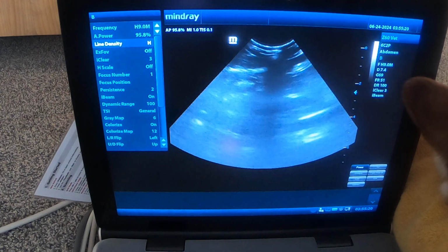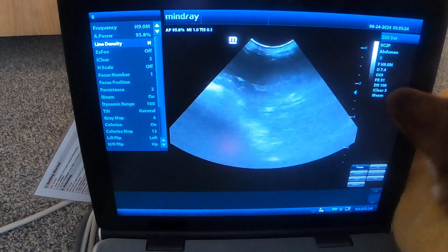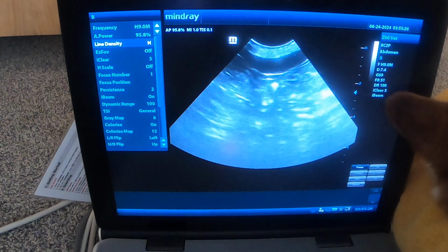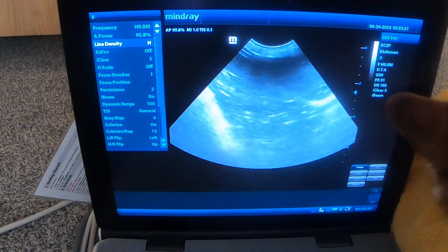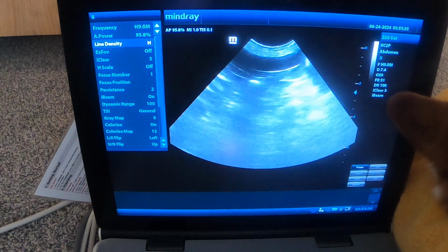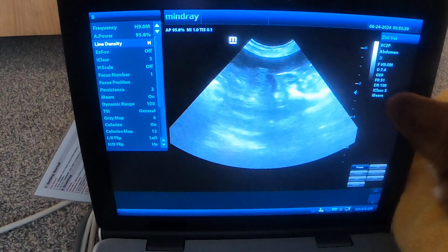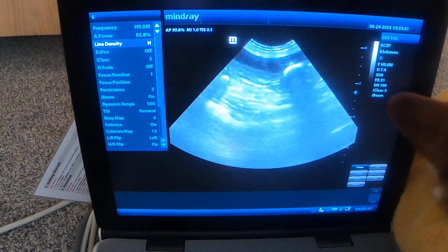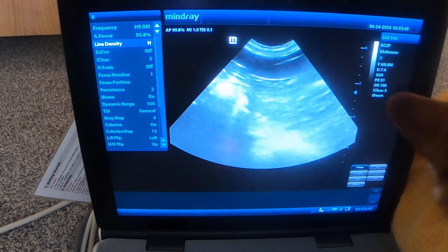I have seen some texts where they talk about an additional kind of umbilical view, and they'll actually get the patient either standing or in sternal recumbency and actually stick the probe right around the umbilicus area and look for any fluid that way. I think maybe if it's just a very gravity dependent small amount of effusion that you didn't see elsewhere, that you might pick it up that way. So this is me kind of sitting right about the umbilicus now, kind of looking around.